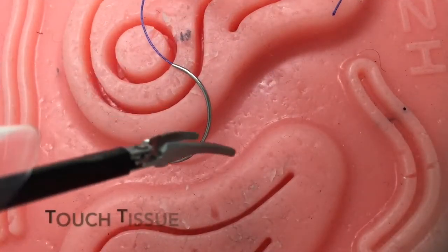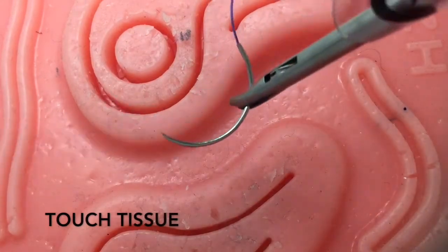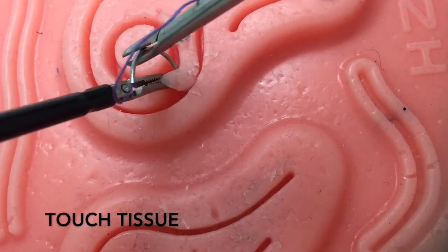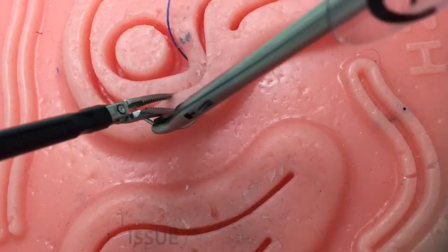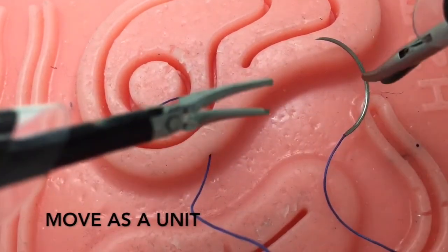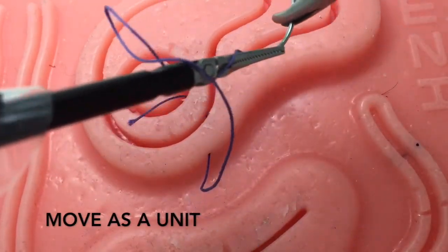Touching tissue will help you overcome the two-dimensional display in a three-dimensional environment. And lastly, moving the two instruments as a unit will make your actions more directed and efficient.